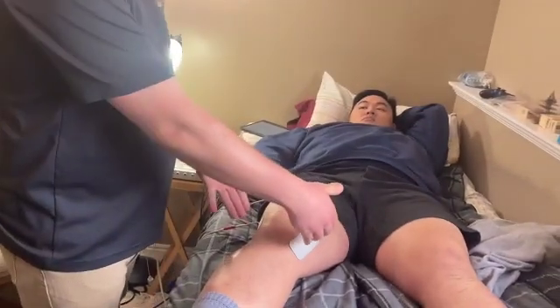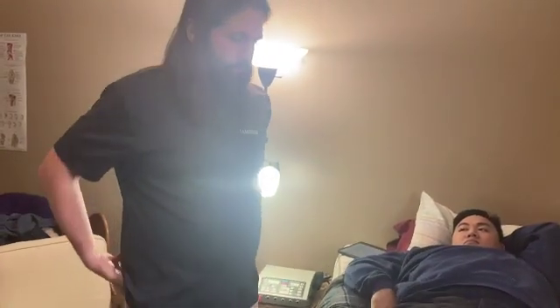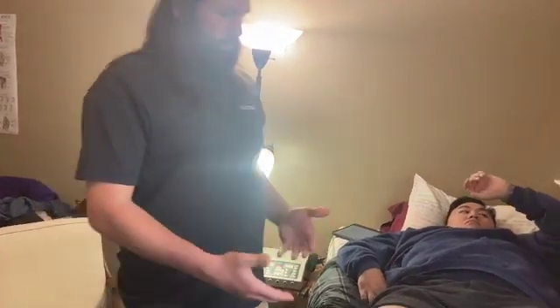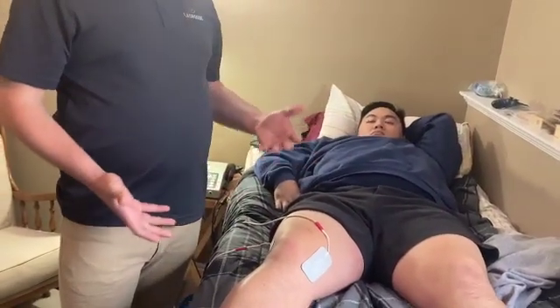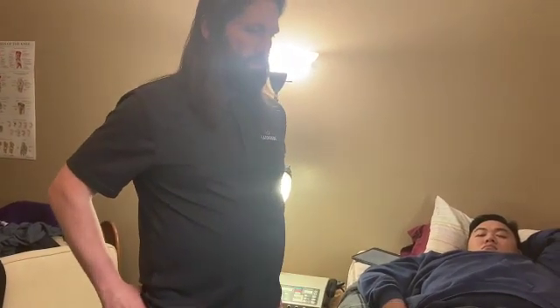So by doing it this way, we're going to get the current going through his tissues around where he's going to experience his osteoarthritis symptoms. And it's going to stimulate those A beta fibers and prevent those A delta and the C fibers from spreading their nociceptive signals at the dorsal horn further up to the brain centers. So this should help to effectively block his pain during the treatments and after, and make the rest of what we want to do in terms of his exercises for his appointments today and in the future a little bit more tolerable.